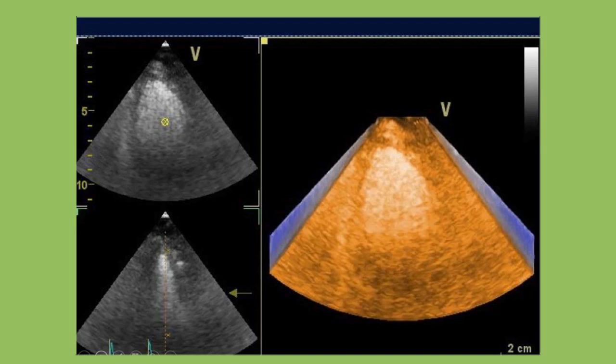But as you can see, there is a small caveat, and that is the shadowing artifact that you are going to get in the ventricle out of the presence of the amount of contrast that you will have when you capture this pyramid of information. I don't have to tell you sonographers, you can already know what is going on. I have beautiful endocardial border definition for the mid and the apical segments, but I have no clue where the basal segments are located.